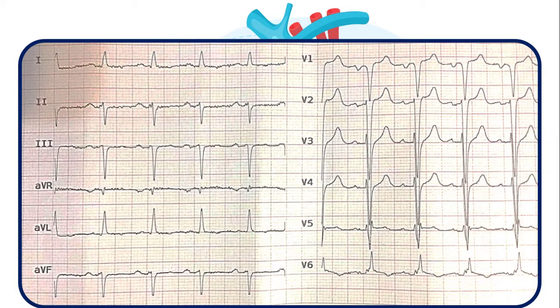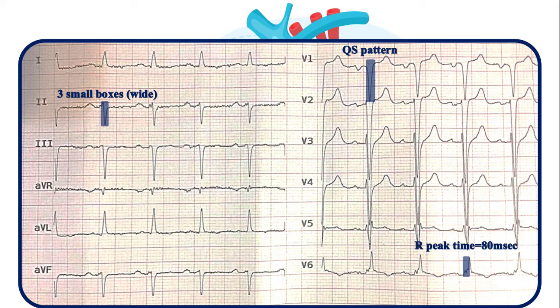Here is the next example. Is it LBBB or not? The duration of QRS complexes is 3 small squares. The complexes exhibit a QS pattern in V1. R-peak time in lateral leads is about 80 milliseconds, which favors a slurred R-wave. So the QRS complex changes are due to typical LBBB.